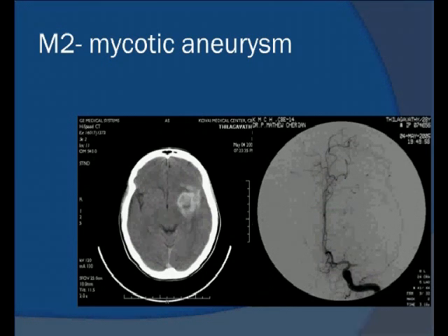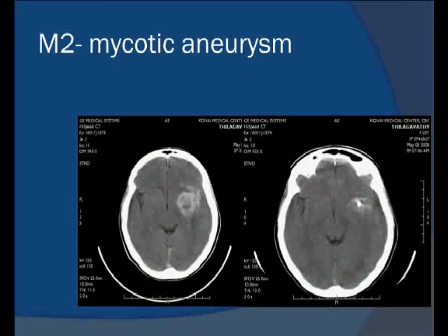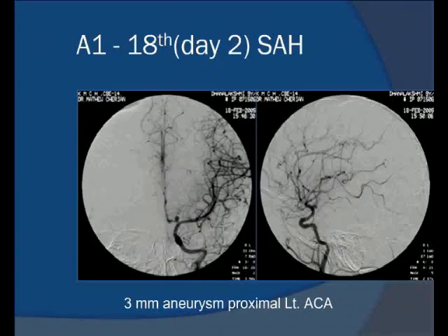off the parent artery completely, which is the treatment of choice for mycotic aneurysms, the collaterals on the opposite side will take over, and this is what we show in the picture, the leptomeningeal collaterals filling the distal branches. And this is a CT taken a few days after coiling, showing there is no progression of the infarct at all. Here is another patient with a mycotic aneurysm.